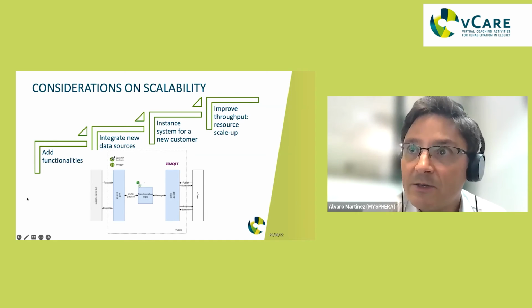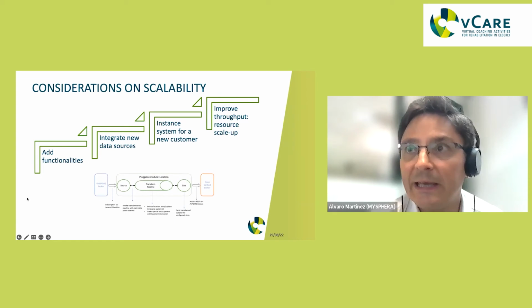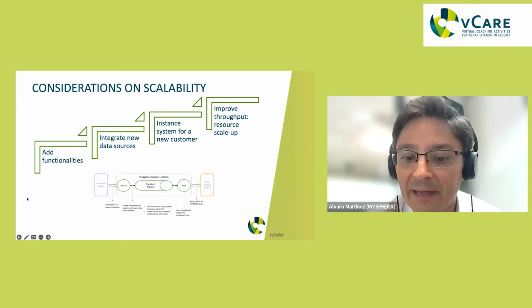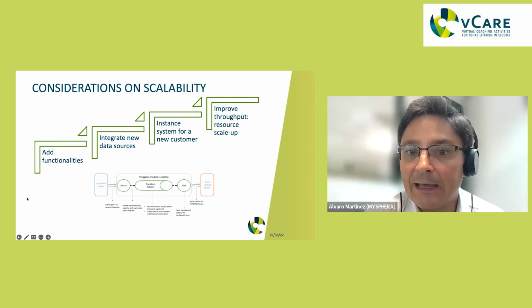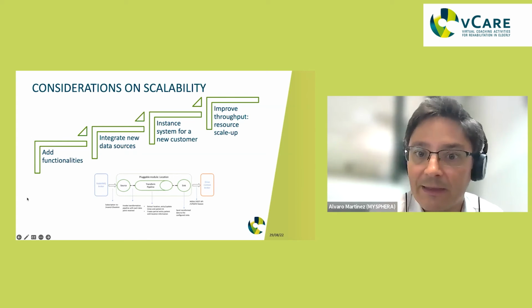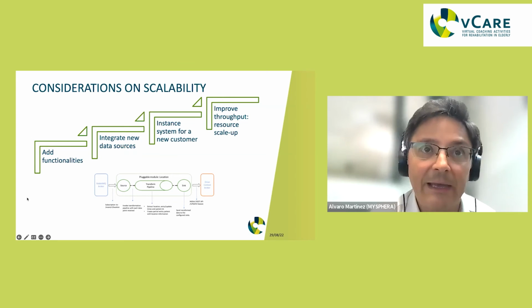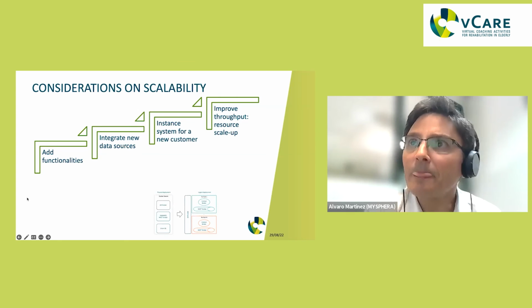The next level of integration, next, Emmanuel, is the integration of new data sources. This could be new devices, or it could also be remote APIs like Fitbit, for example. So basically, we only need a client which is interfacing with a device or with that external API and transforming all the information into the formats that MQTT understands. And also, we need to define the topic tree in MQTT to make sure that we are not overwriting some important information.